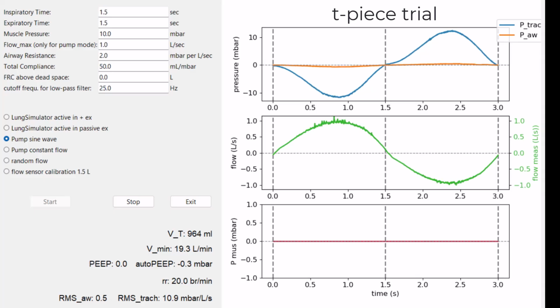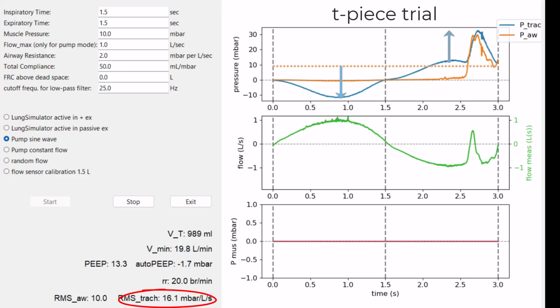And so now what you just saw is we switched to a T-piece trial. So we disconnected the ventilator and now the airway pressure is constant and the tracheal pressure in inspiration decreases by this 10 centimeters of water and increases in expiration by about the same amount. And now you see the effective resistance is 10.9 millibar per liter and second.